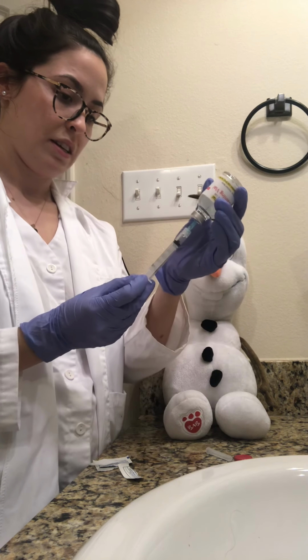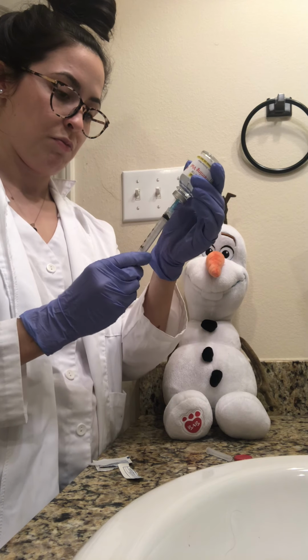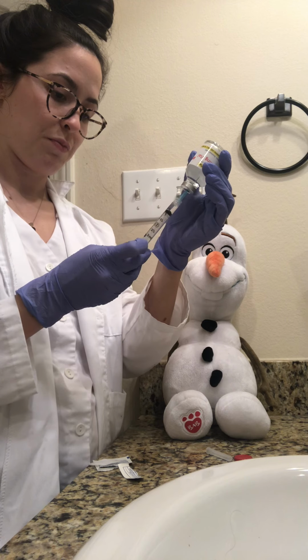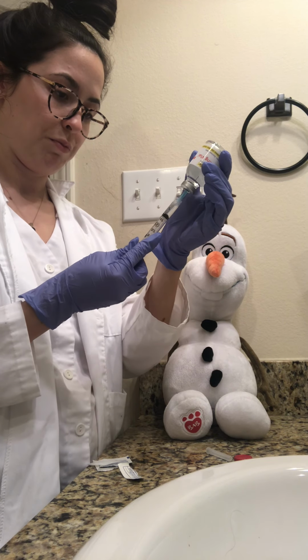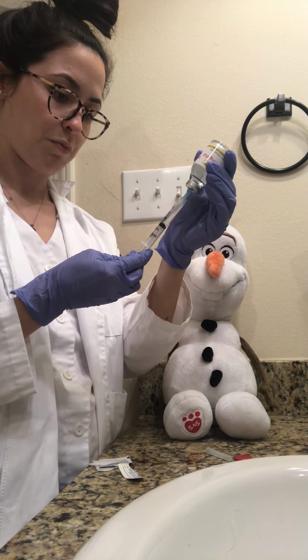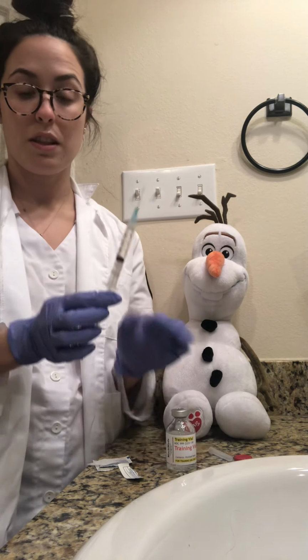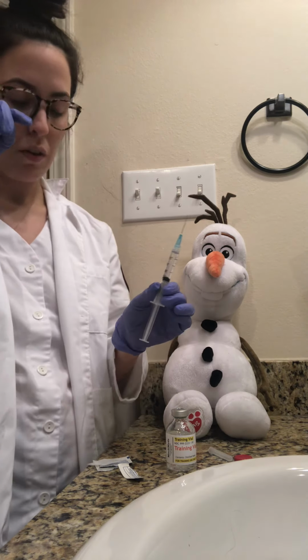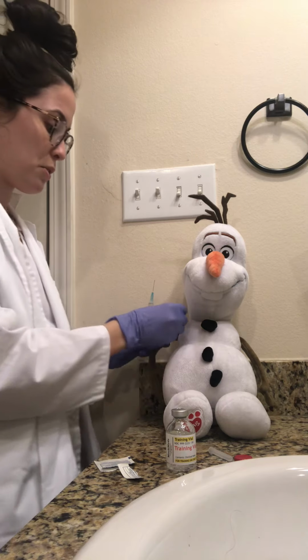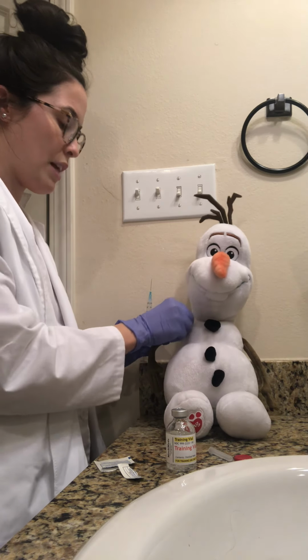Alright, and then we're going to pull back 2 milliliters. Alright, so now I have 2 milliliters of the medication in the syringe, and then just before I inject it into the muscle, I want to make sure I clean it with an alcohol swab real good and let it dry completely.